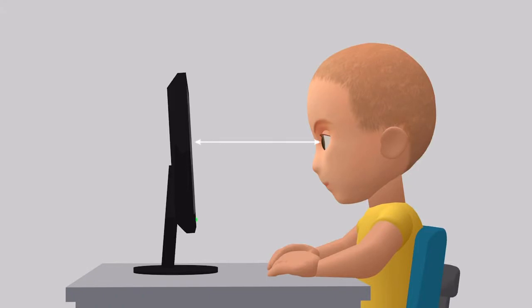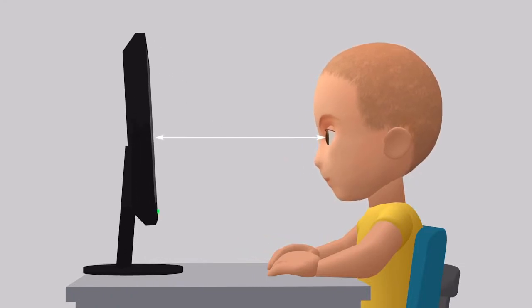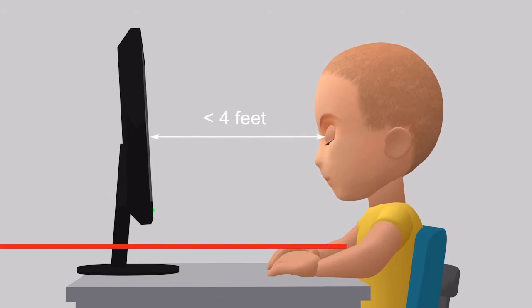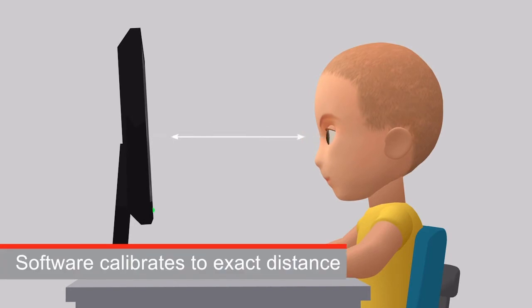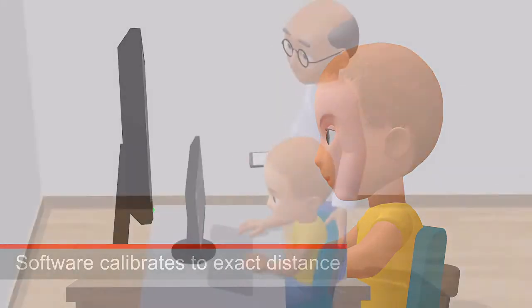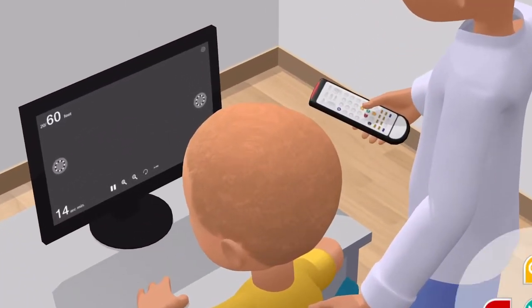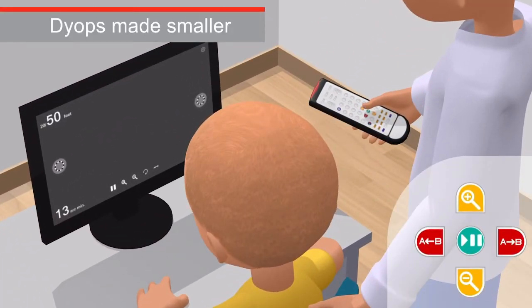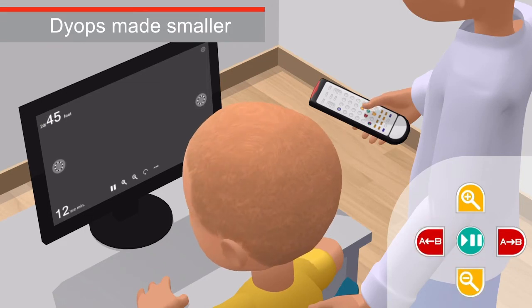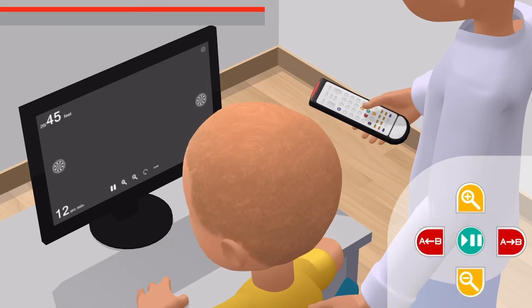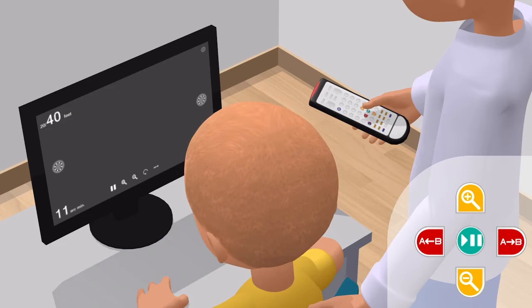The child should sit close enough to the monitor, approximately three feet or less, to ensure the head or eye movements noticeably change when tracking the location of the spinning DIOP. As the examiner makes the DIOPs incrementally smaller, the location of the rotating DIOP alternately switches. The child's head or eyes will naturally move from side to side to track that rotating DIOP.